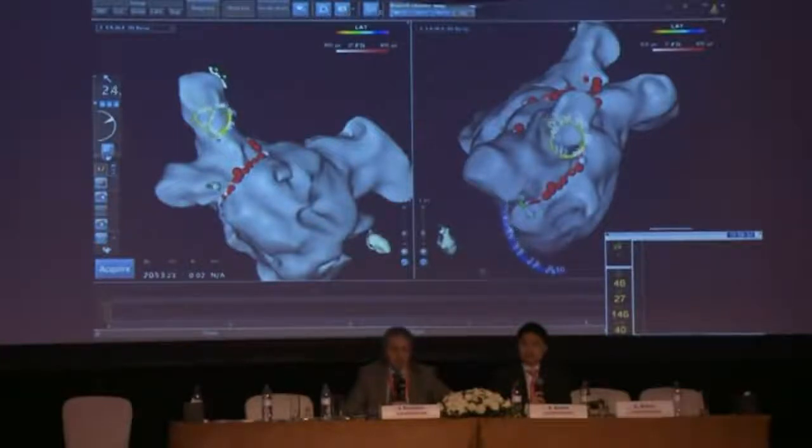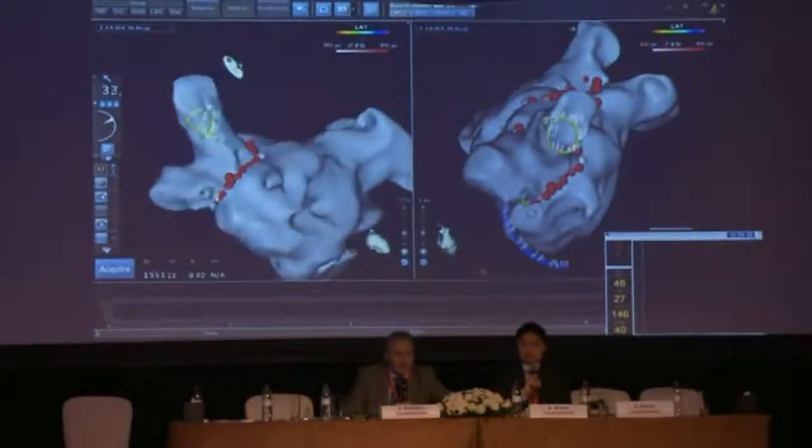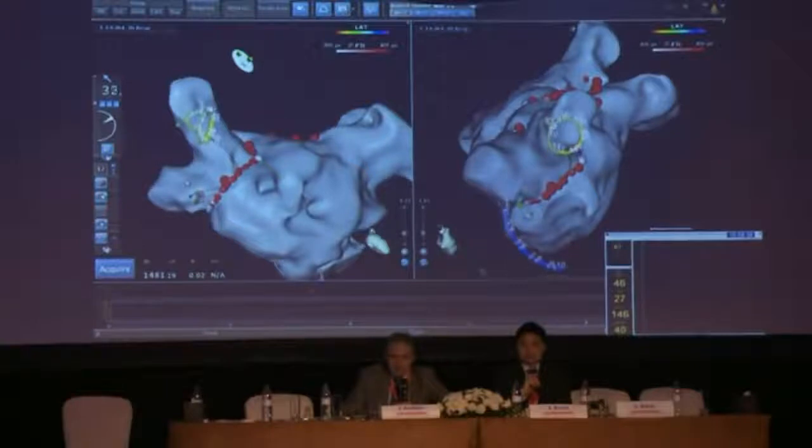Yep. We're just going to do the pacing maneuver. I've got the catheter in the right lower now, and we're going to pace and see what the right does. You can see there's the right upper dissociated from the AF, so we've isolated the two together as a pair.